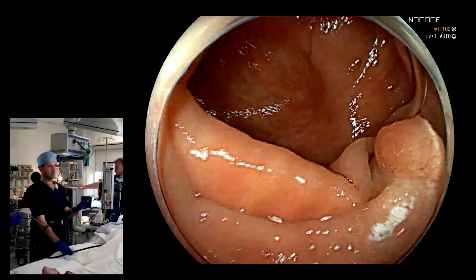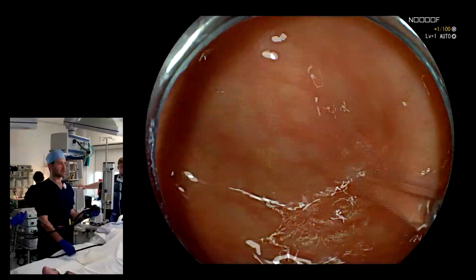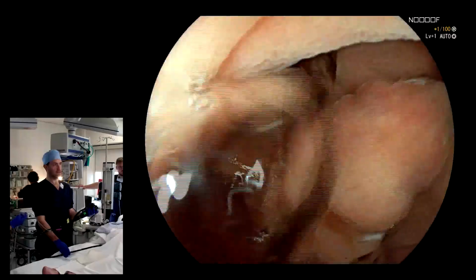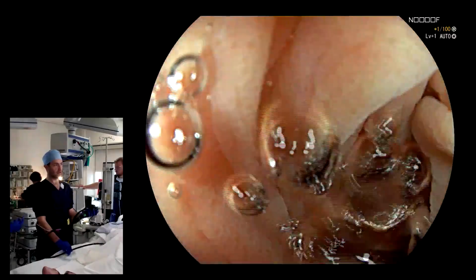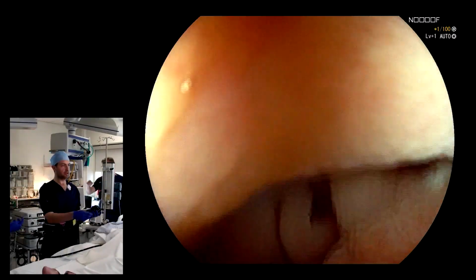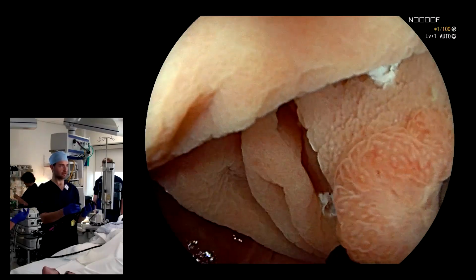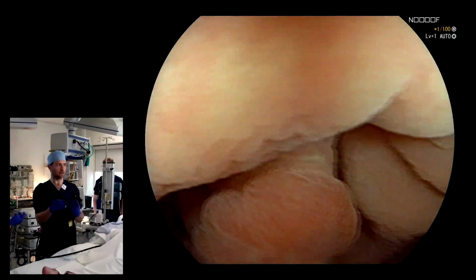And maybe we can mark it with water. So let's just see if that's possible. Soft coagulation does work underwater, but you may need to play with the settings. So you can see already nicely that that mark I put before did work at the back there. Take the air pocket away. And you can see how that does allow access to the back. There's already a mark here. It'll also be interesting to mark there and there. I don't think you can have too many marks, to be honest.